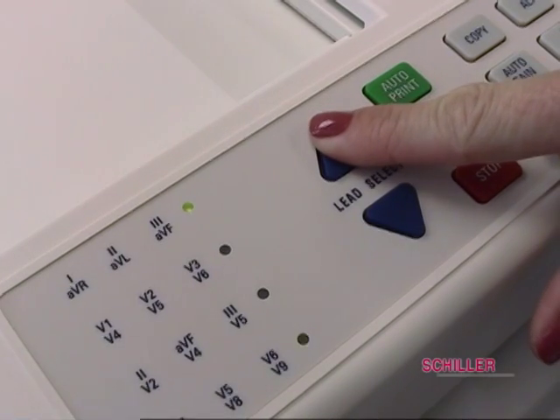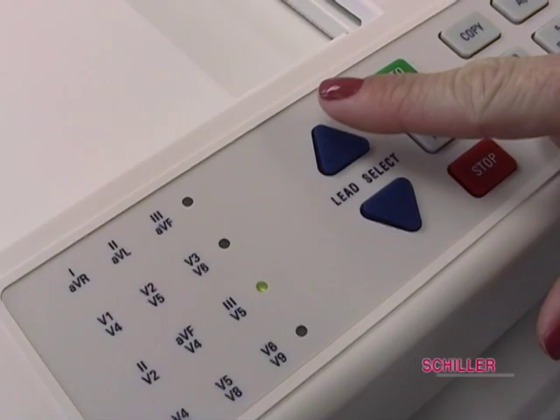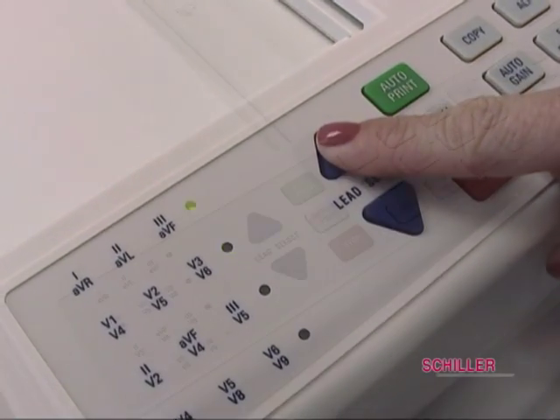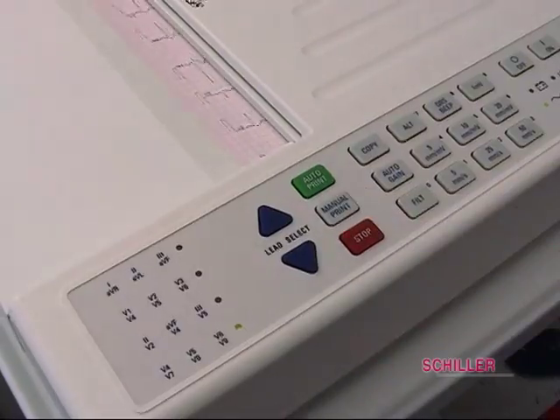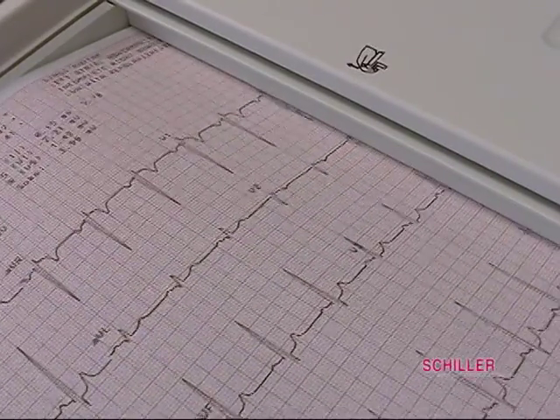On the keyboard, the left side LED indicator shows the lead group that will print in manual mode. The triangular keys up and down will change those lead groups. The green button auto start is for auto ECG. Manual print is for print out of the lead group indicated on the left side.